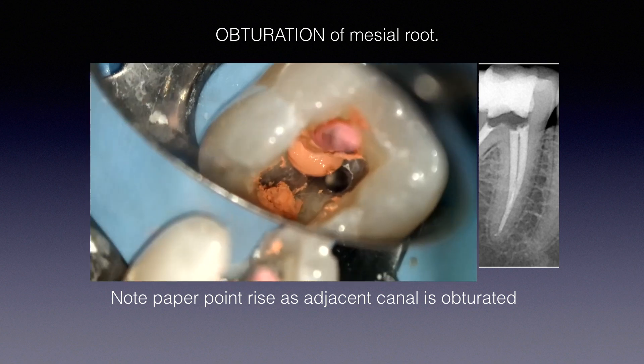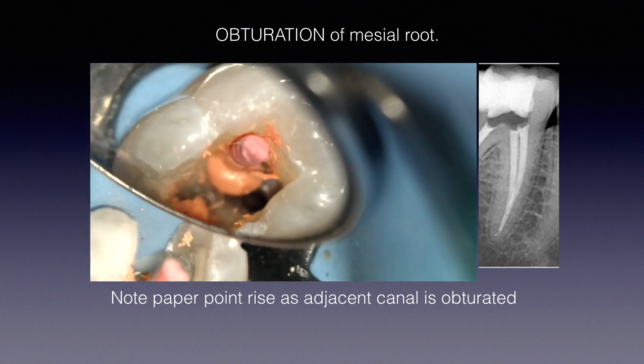I remove the paper point and now I can obturate the second canal. Zooming in with the microscope into the unobturated canal, you can actually look inside and see that white area — that's the obturation already filling the second canal. Imagine both canals are 20 millimeters individually. We've obturated one to 20mm and it has backfilled the other perhaps 5mm. Now if I place the Gutta-Core to 20mm, will I extrude material out the apex?